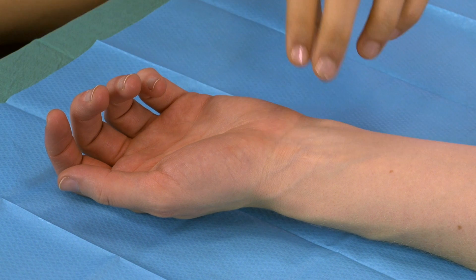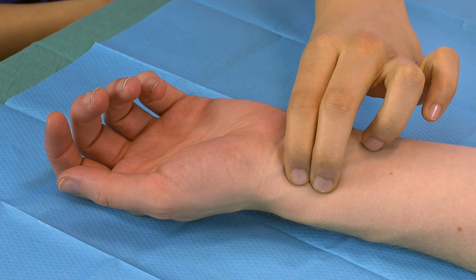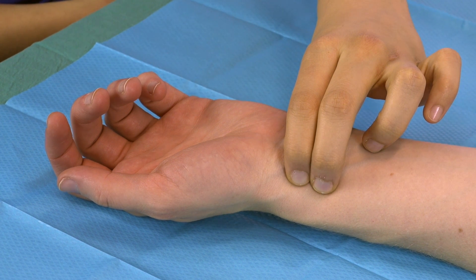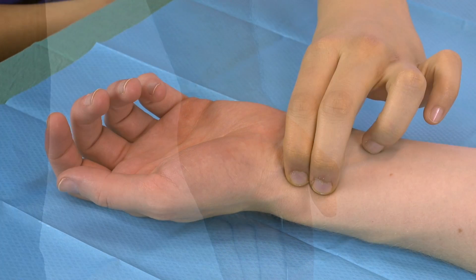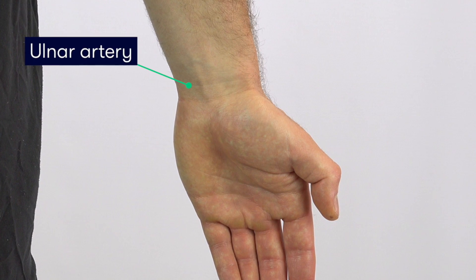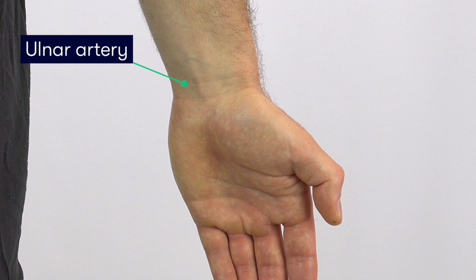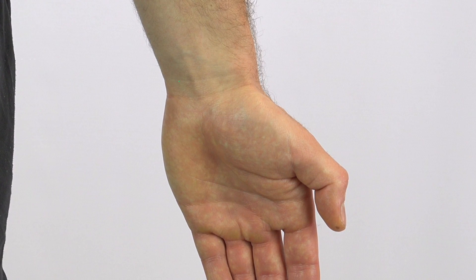Having ensured that there are no contraindications to performing a puncture at the site of the radial artery, we then need to palpate the artery to ensure that there's a good pulsation. We will use this pulsation to help guide the insertion of the needle. Once we are happy that there is a good radial artery pulsation at the proposed site, we must then ensure that there's an adequate collateral arterial supply to the hand via the ulnar artery. We achieve this by performing the Allen's test.